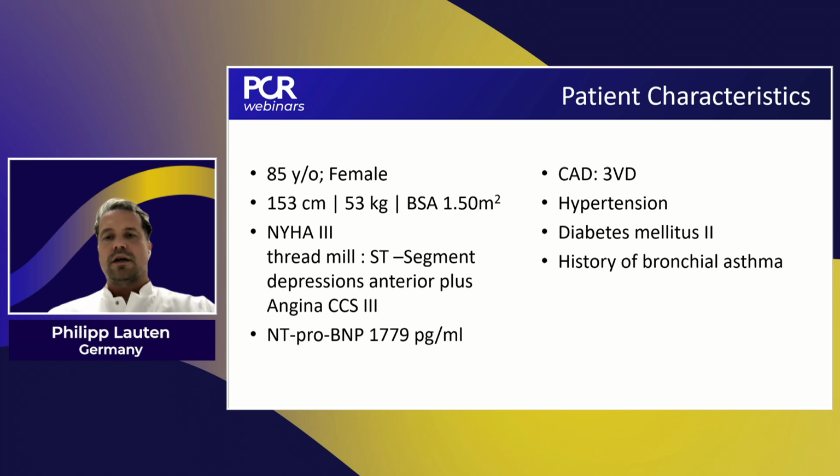So echocardiography, as I mentioned, high flow, high gradient, nearly clear: 62 to 41 millimeters of mercury, normal ejection fraction, opening area 0.8, and stroke volume was fine. So it was a classical high gradient aortic stenosis.